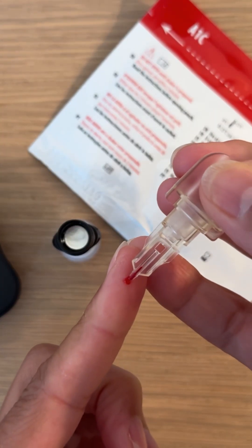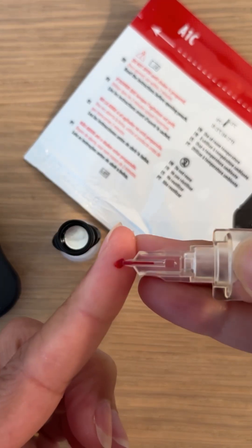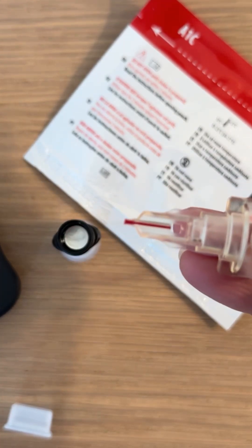You want to collect that blood drop in this collector. I always make the same mistake — the blood drop is not big enough, so I have to redo that. It has to be completely filled with blood.